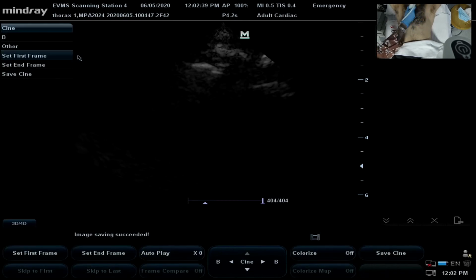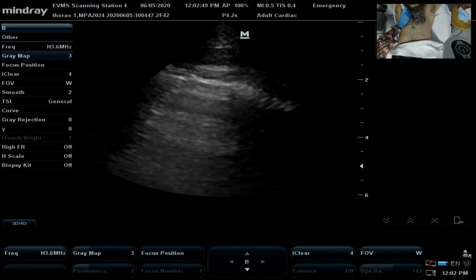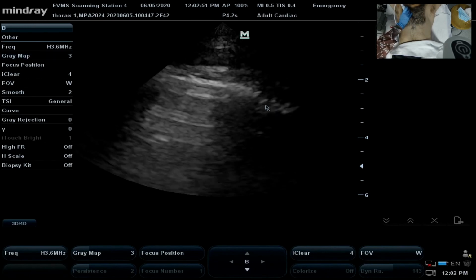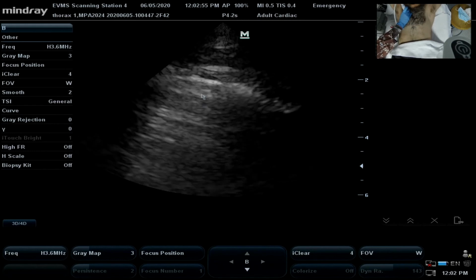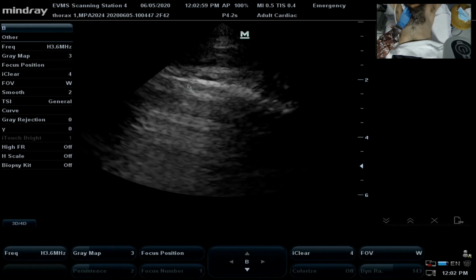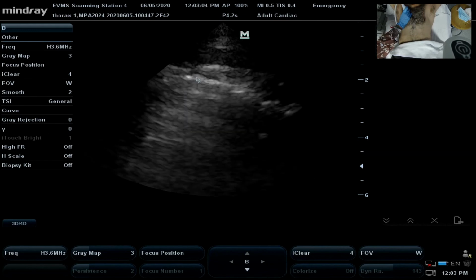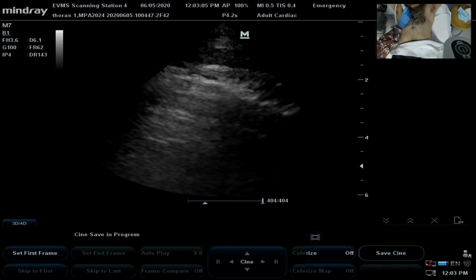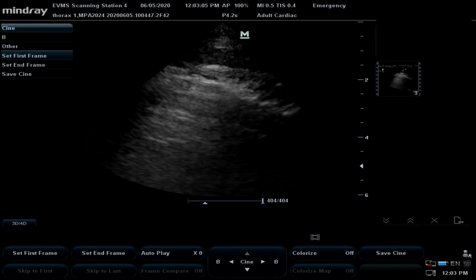Now I'm going to come to the right side of the thorax. Same thing. I'm going to come in between 2 ribs. Here a rib, here a rib. My pleural interface. I see some A lines. They are very normal, don't care. And I see sliding, the little seashore sign for his lungs. Very nice. Done.